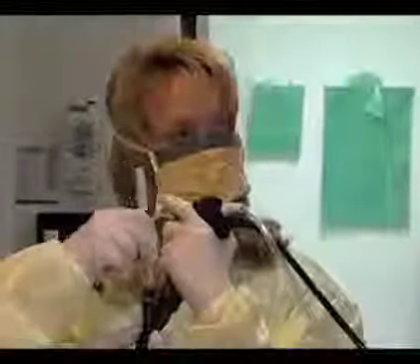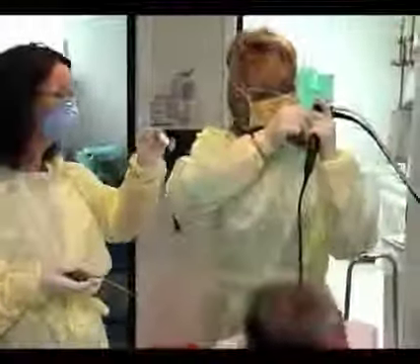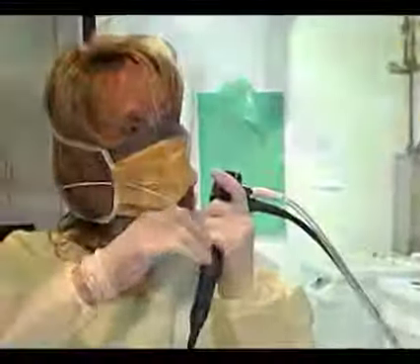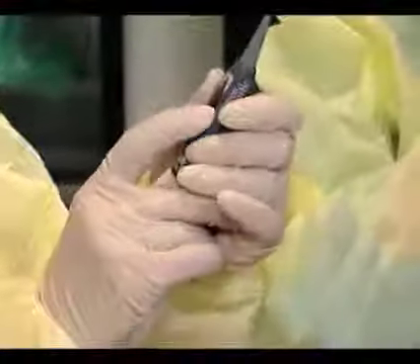The patient tolerated the procedure very well. I think topical anesthetic is very important, to be generous with that. Good communication with your technicians in order to make sure the needle is indeed in the proper position, that the needle is out when you anticipate the needle to be out, that you clear the working channel of the bronchoscope and never have the needle in the out position while you're pulling the needle back through after you've obtained the biopsies.